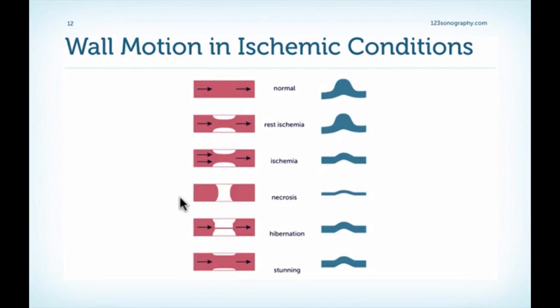If the patient had an infarct, there is an occlusion, then there is akinesis and the wall is thin. If there's an occlusion which occurred slowly or there is some form of collateral flow, then there is hibernation. In other words, the patient did not have an infarct. The segment is still adequate with respect to its thickness, but hypokinetic. And very similar, if the patient had an infarct and the vessel was reopened, there is stunning. We also have a normal thickness of the myocardium and hypokinesis.